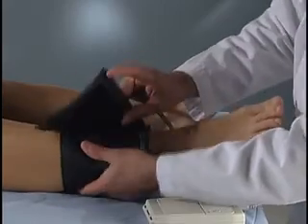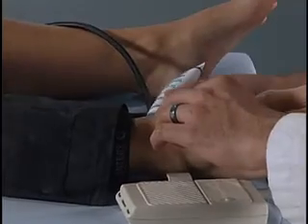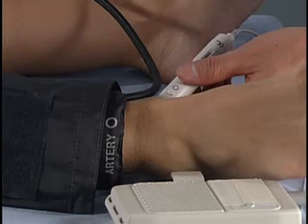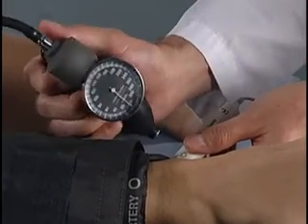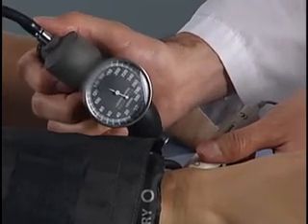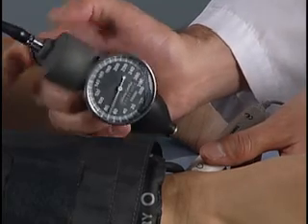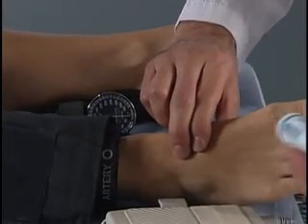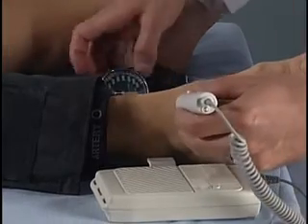Because of its critical impact on health, accurate diagnosis of peripheral arterial disease is important. Careful history taking and physical examination are always required. However, because examiners may differ in their ability to palpate pulses, and because up to 10% of the general population may have congenital absence of the dorsalis pedis pulse, a more objective method to evaluate the peripheral circulation is needed when peripheral arterial disease is suspected. Measurement of the Ankle-Brachial index is a simple, accurate, and generally reliable method for the diagnosis and evaluation of peripheral arterial disease.